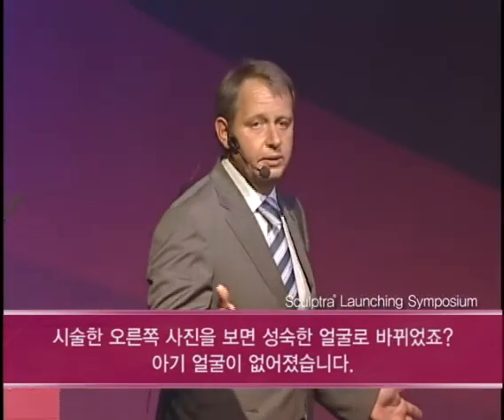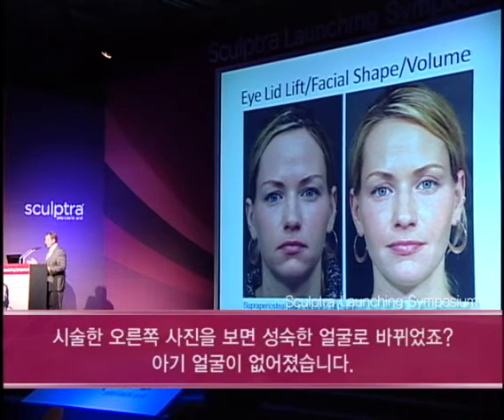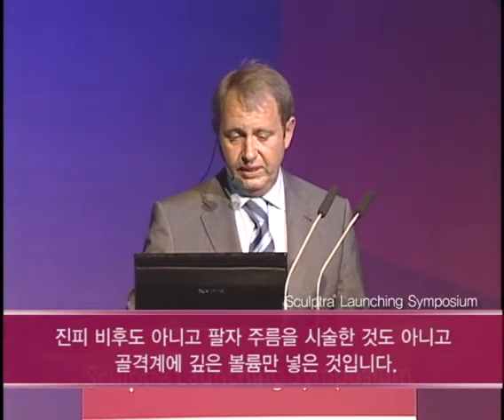So these patients, you can help them by giving them deep volume just on the bone. Make the table bigger and spread the tablecloth. Very simple procedure, 15 minutes, once or twice, with remarkable results. You can see her whole face looks more mature, that baby face is gone. Not dermal thickening, no treatment of nasolabial folds, just deep volume on the skeletal platform. You can read about this in a couple of book chapters we wrote about it, and in a very recent article Dr. Kim already mentioned.